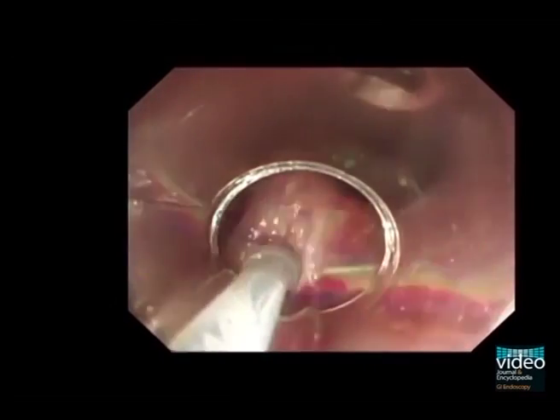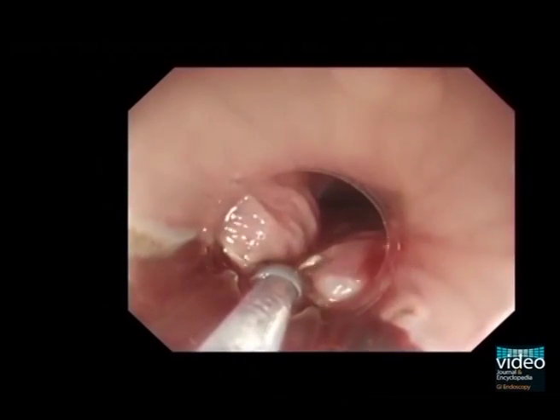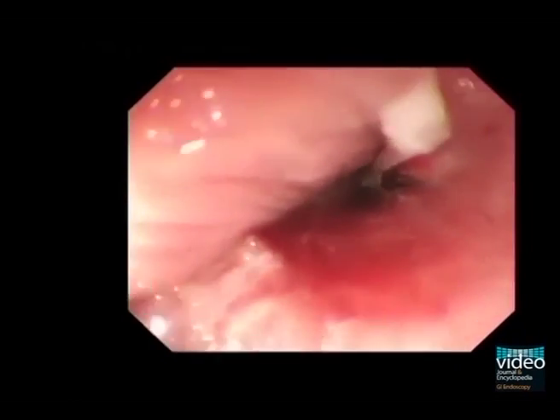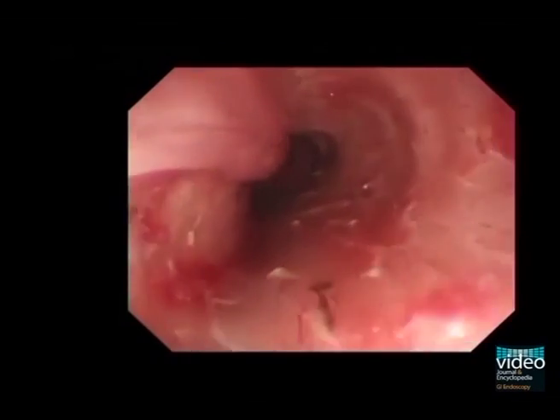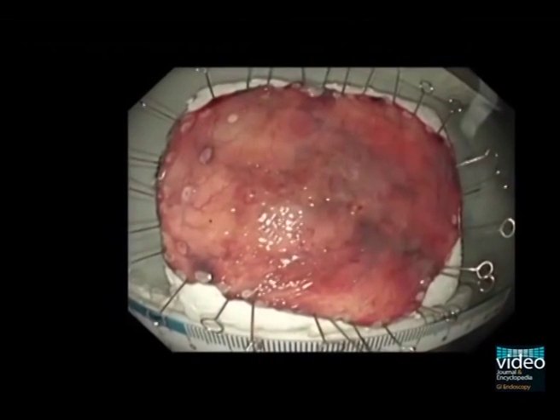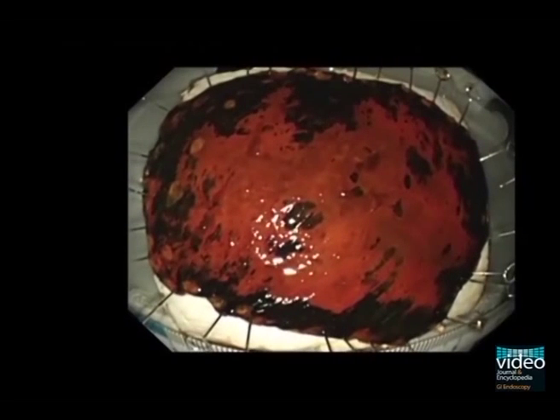This is the final step of the endoscopic submucosal dissection. The tumor was resected without any complications with a procedural time of 150 minutes. Pathologically, the resected tumor was an intraepithelial esophageal squamous cell carcinoma with negative lateral and vertical margins. There was no recurrence for 30 months after the endoscopic submucosal dissection.